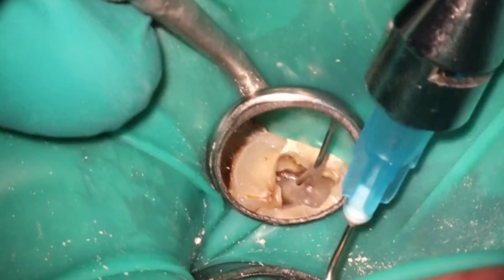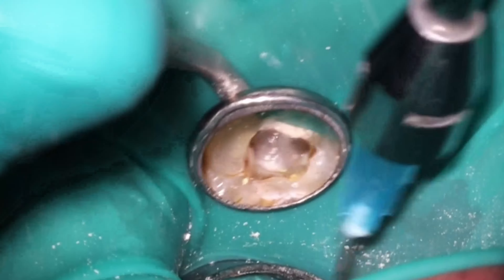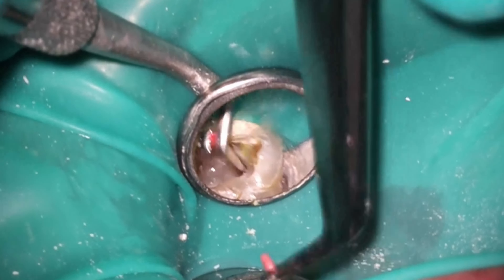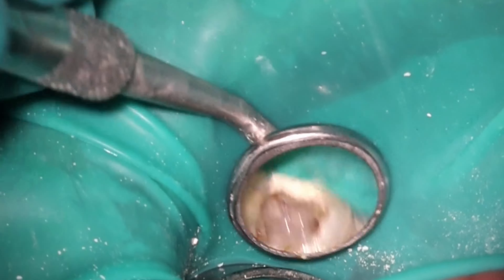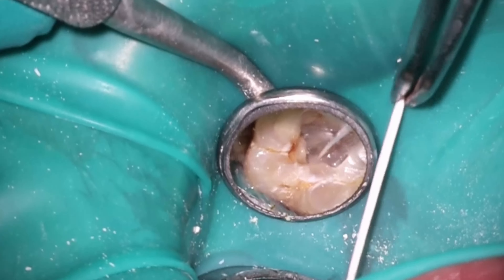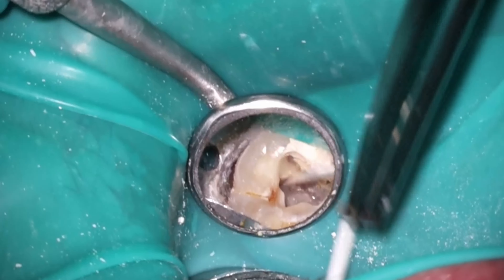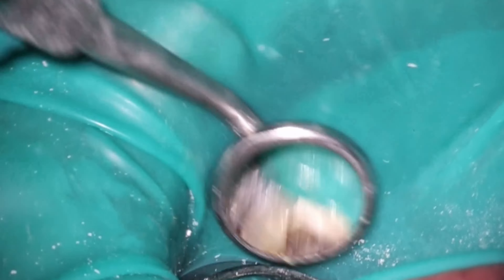If you look, you can still see a little bit of yellow granules up and down here — that's because this stuff just never comes out. It's so annoying. You've seen some pretty good chunks come out of this tooth as well. The rest of it is really straightforward. We're going to dry it and do the squirt fill on this one. I got the lengths off of the cone beam as well as the working length from the apex locator. It's pretty straightforward from here on out. Thankfully, the dentist did request no restore.